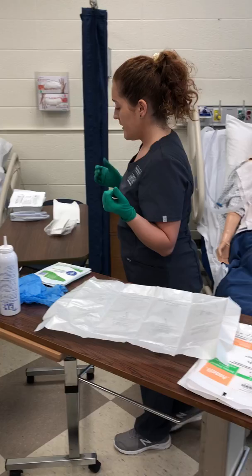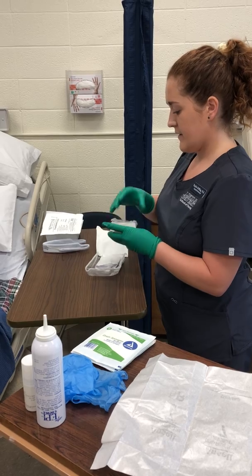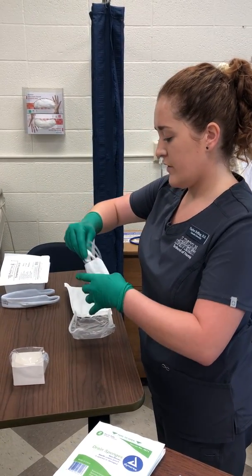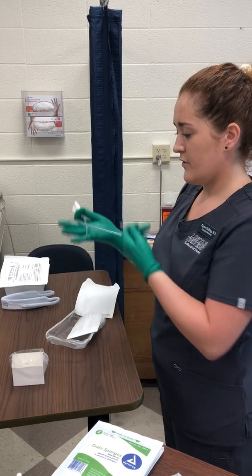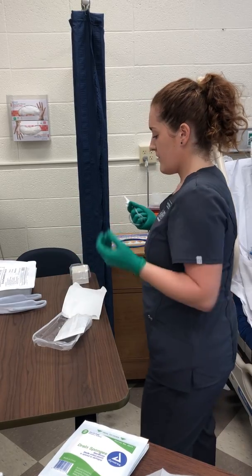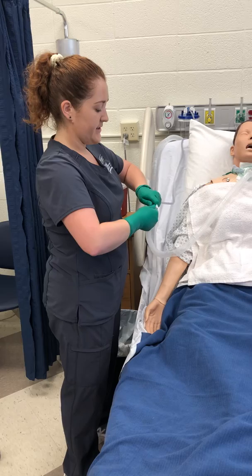Now that I have my sterile gloves on, I'm going to set this out. This box is going to have some normal saline in it — I'll have an assistant put that in for me since I am already sterile. I'm going to get our suction tubing out and wrap it in my dominant hand. With my non-dominant hand, I'm going to break sterility and attach the suction.